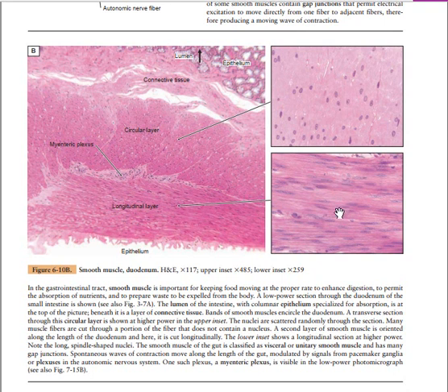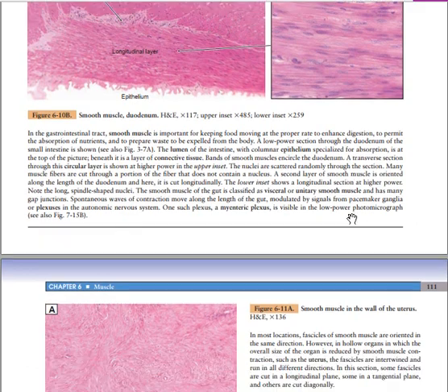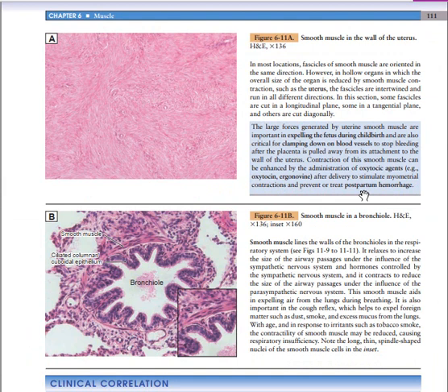They have elongated nuclei, just like the fibroblast. They're spindle-shaped just like the fibroblast, and they don't have striations. Just that relative to the fibroblasts, they are much more eosinophilic, that is pink, on hematoxylin and eosin stain.